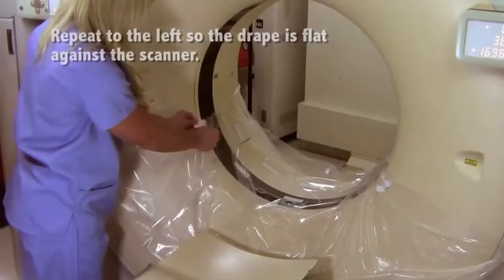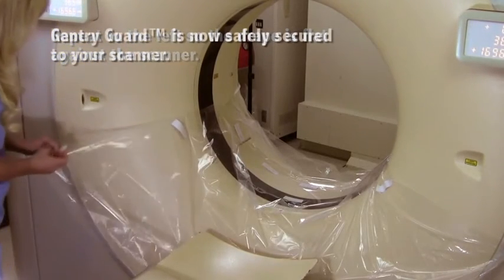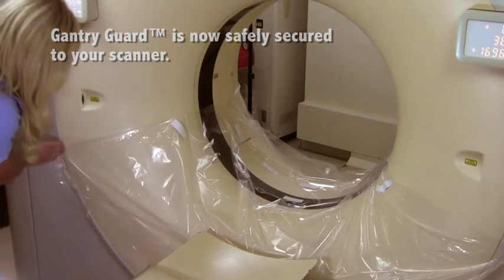Repeat the process to the left so the drape is flat against the scanner. Gantry guard is now safely secured to your scanner.